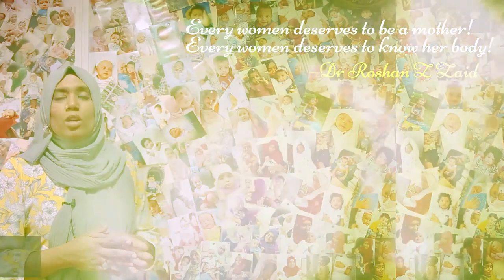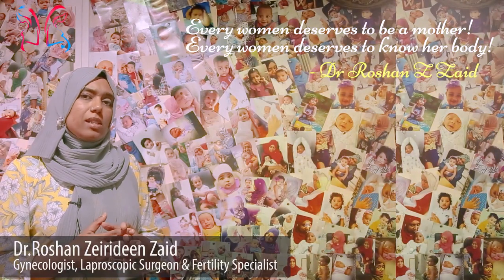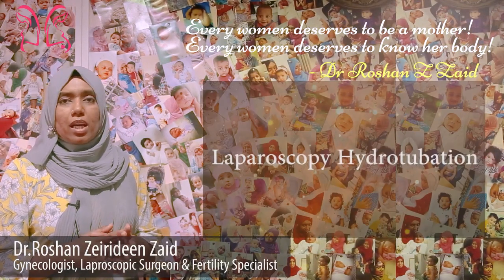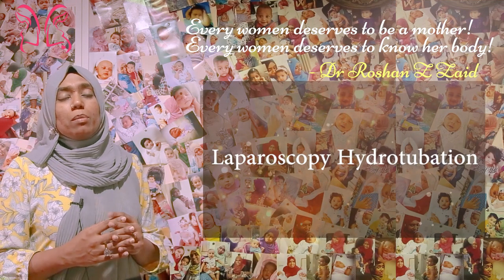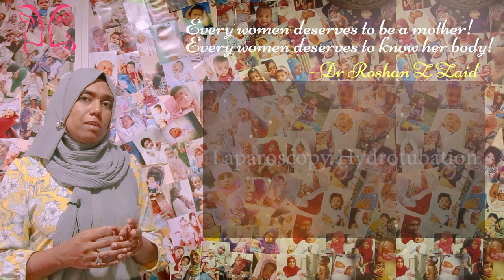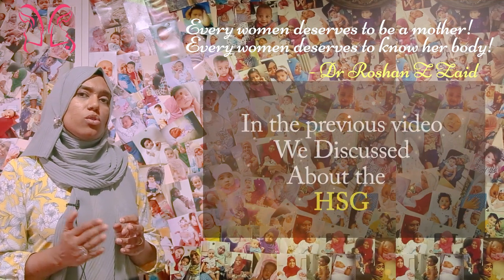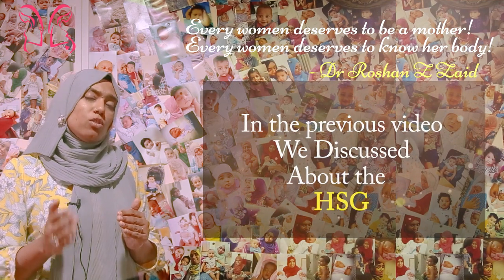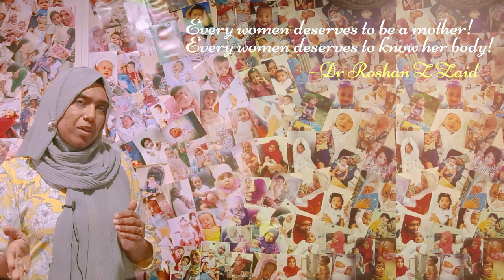Hi everyone. Today I will be discussing laparoscopic hydrotubation. In my previous video I discussed HSG, which is hysterosalpingogram. Today I am moving on to laparoscopic hydrotubation.